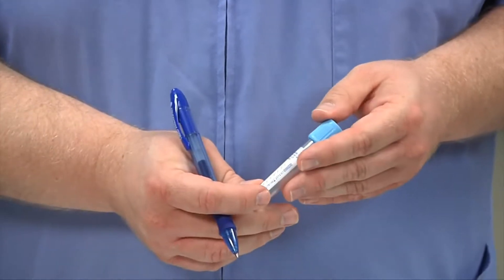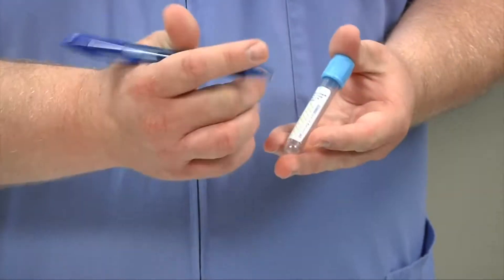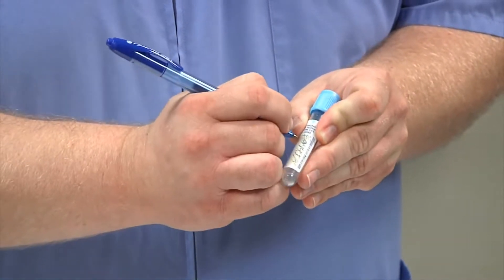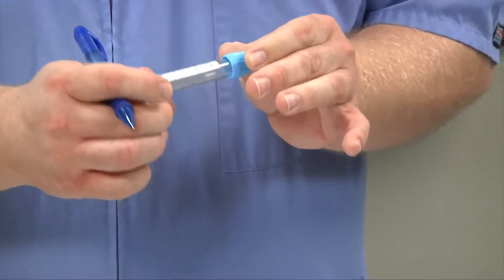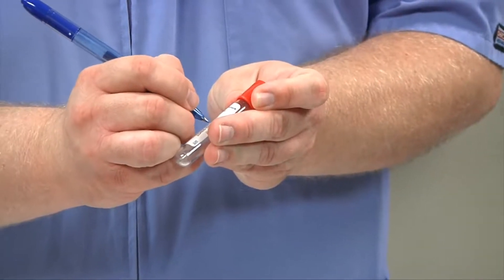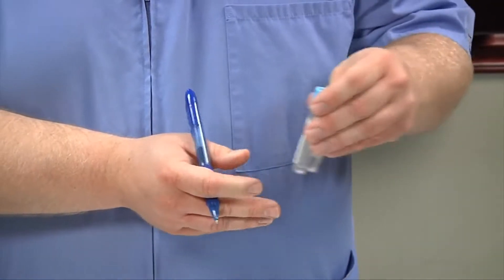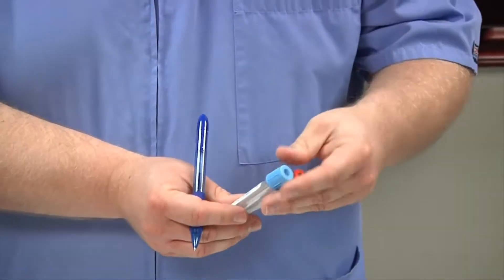As the very last step of phlebotomy, after you've bandaged your patient and disposed of all your equipment and your patient is safe and not bleeding anymore, you want to label your tubes with the patient's name — in this case, 'Banana' — along with today's date and your initials. This needs to go on every tube that you draw. Both tubes would then go in your lab specimen bag, and you would transport them to the laboratory, either by the pneumatic tube system or by hand-carrying. That's the last step of the phlebotomy blood draw.